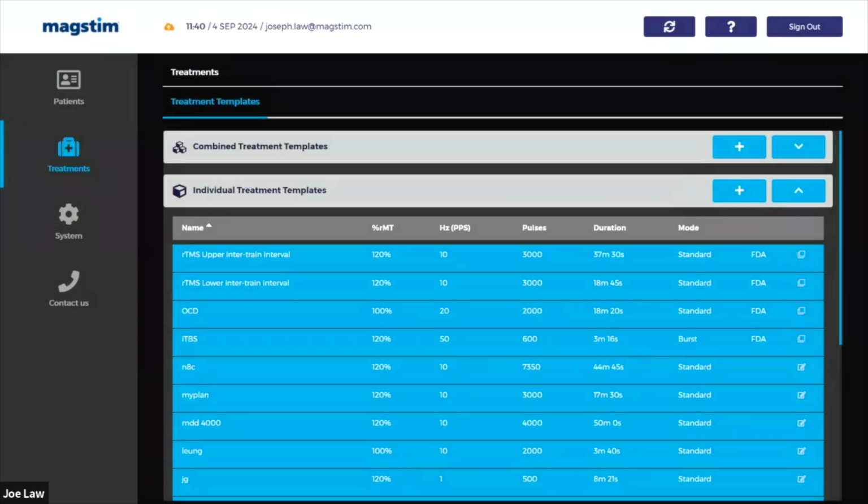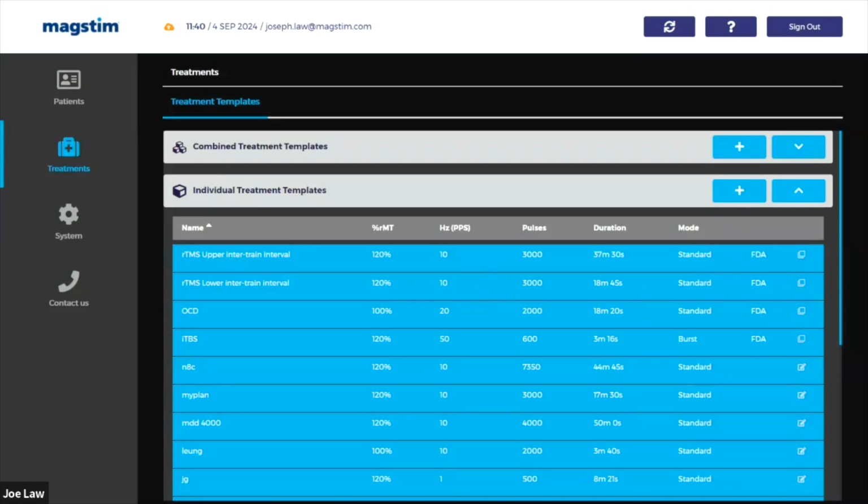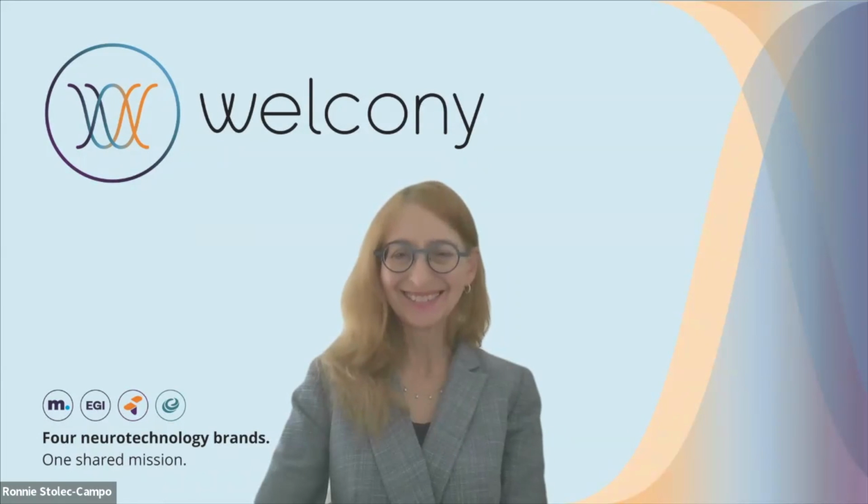What you can also do is click on one of your defaulted treatments. You can then adjust your current treatments that are already set up by default. So just because you've added it, it doesn't mean you can't make adjustments after the fact. Or again, you can even remove it. If you feel like you put it in error or it's something you're not going to use in the future, you can remove the treatment that's been put in place. So yeah, you can do that. Perfect. Thank you. Thanks, Joe.